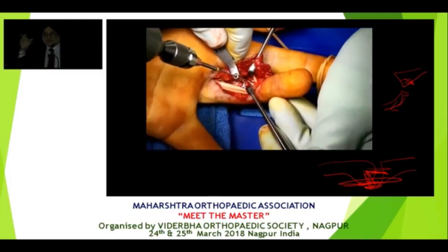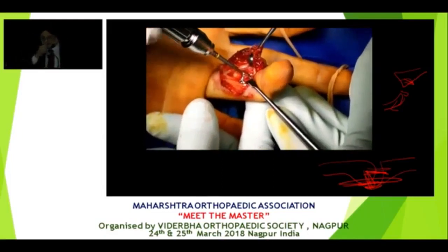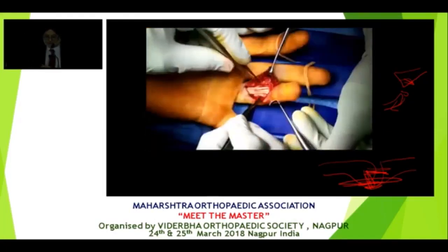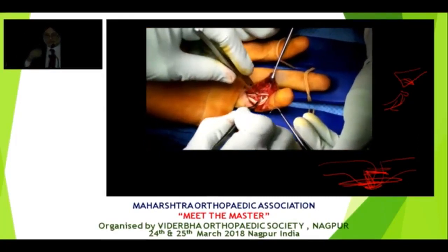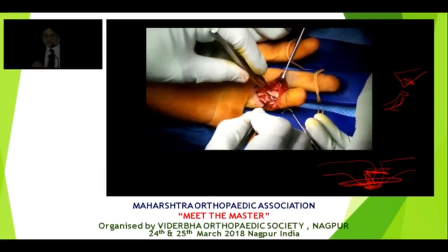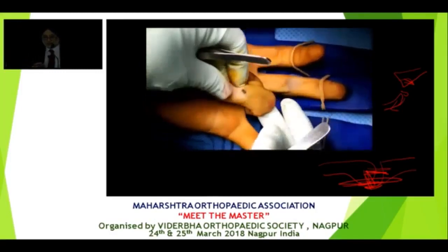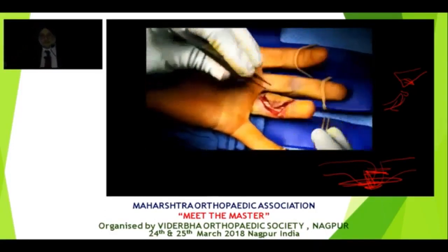We take an X-ray because you can't see the reduction, right? This is like volar plating of radius. You can't see the reduction. So you take an X-ray. We're putting screws in there. Now the fracture is immediately stable because you've corrected the depression. Now we don't want the tendons to rub on the plate. So we take the A2, A4 pulley and we put it over the plate under the tendons. You see this? The patient is fully stable through a full range of motion.